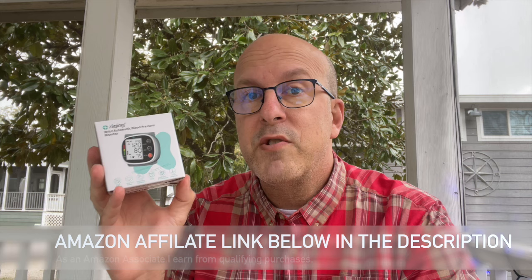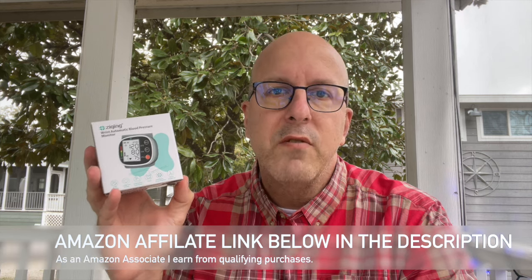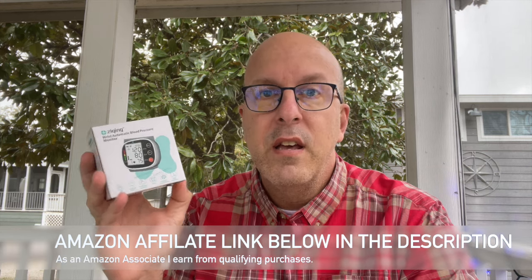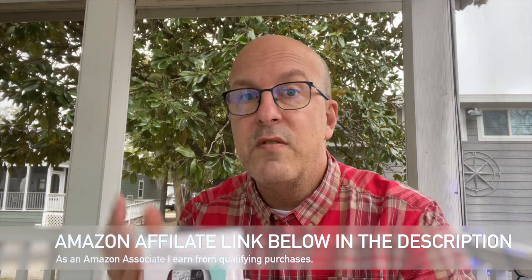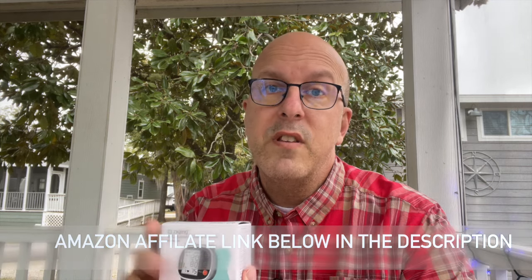Hey everyone, welcome back. Today we're checking out the Ziqing wrist automatic blood pressure monitor. You can find this blood pressure monitor on Amazon for under $20 — I think I got it for $15.99. What I want to do is unbox it, take a look at it, give it a test run, and tell you what I think about it. So let's get to the unboxing.